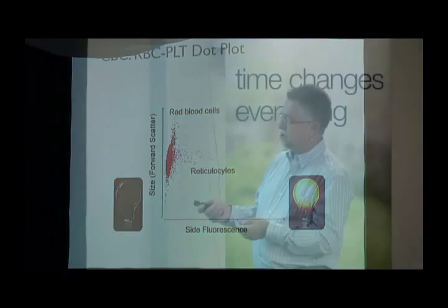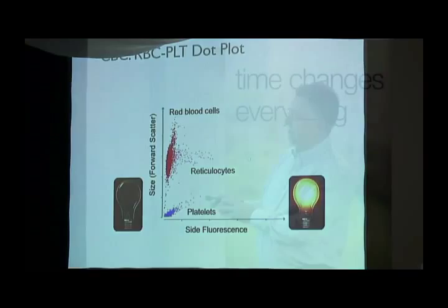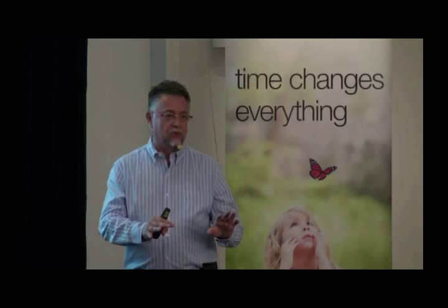And the platelets, remember, are tiny, so they are at the bottom of that vertical axis, but they have those little blue granules that are RNA, so they stream up and to the right. And remember, if this is a cat, there will be platelet clumps all the way up to here. In the cat, if you look at a cat funny, the platelets clump. You don't even need to draw the blood. You go, ooh, and the platelets are clumped. You see, I scare you. You have to be paying attention.